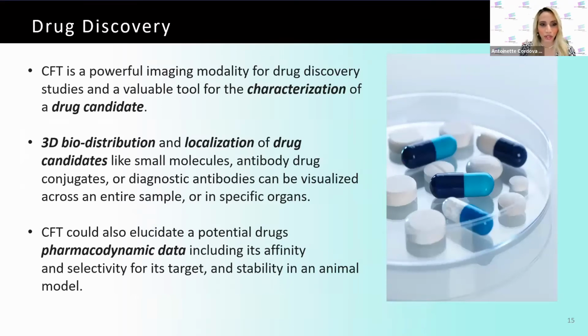I will now highlight drug discovery, one of my personal favorites. For example, with CFT, we can characterize a drug candidate. The importance of biodistribution is integral. Where is a drug going to the site of interest?